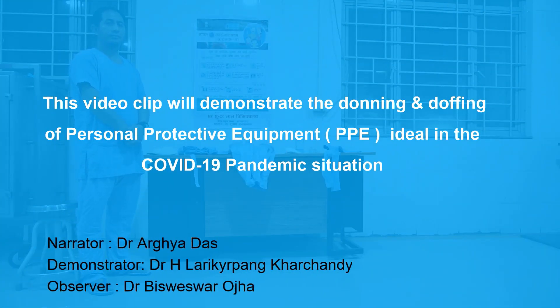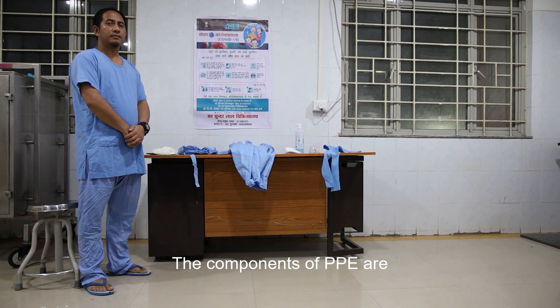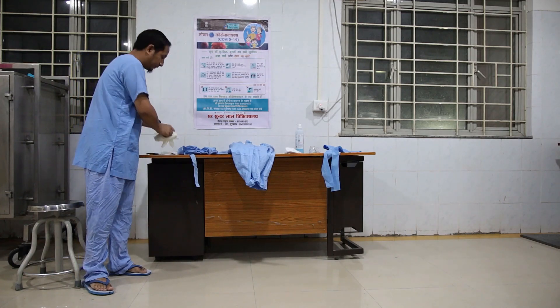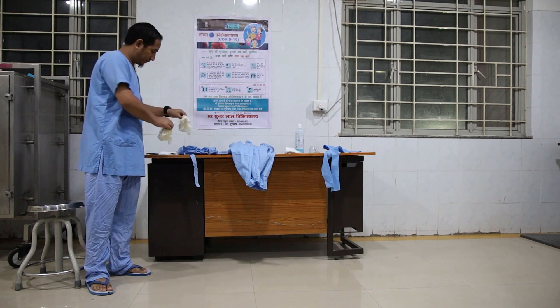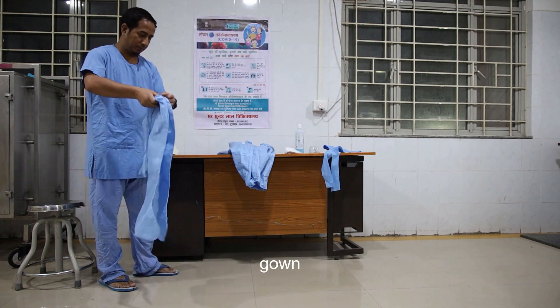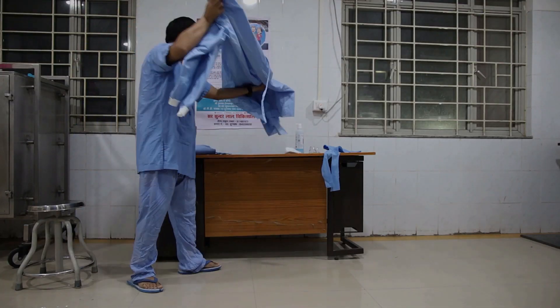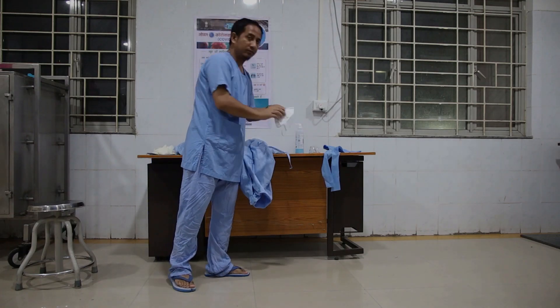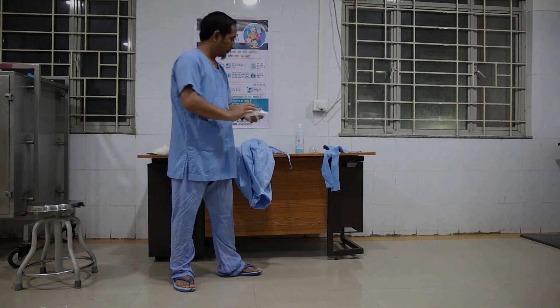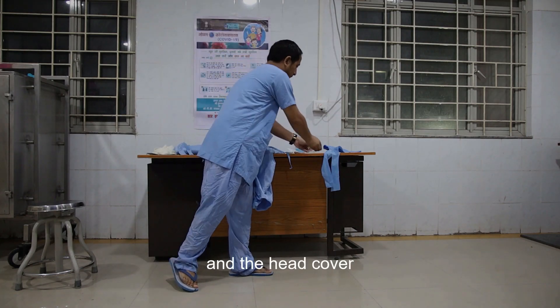This video clip will demonstrate the donning and doffing of personal protective equipment, or PPE, ideal in the COVID-19 pandemic situation. The components of PPE are: two pairs of gloves, shoe covers, gown, N95 mask, goggles, and the head cover.